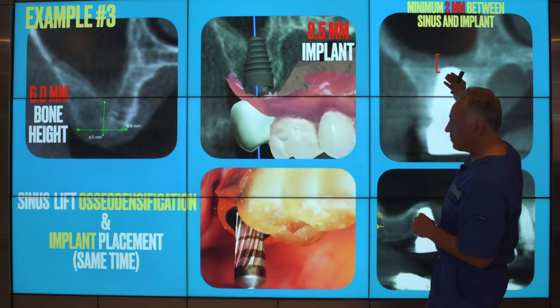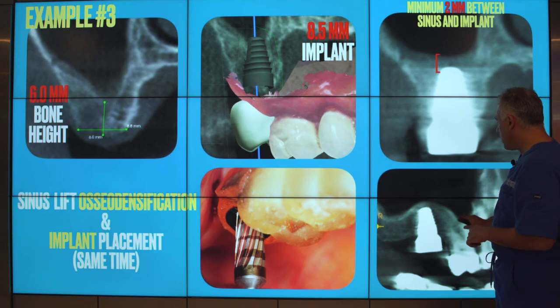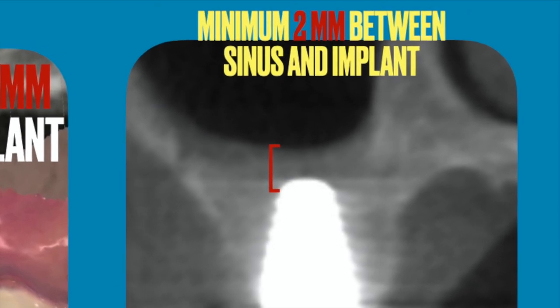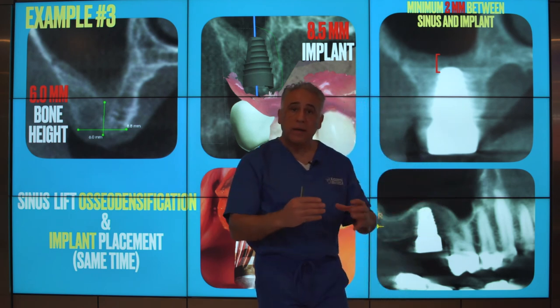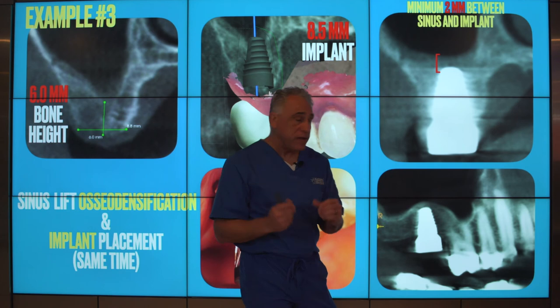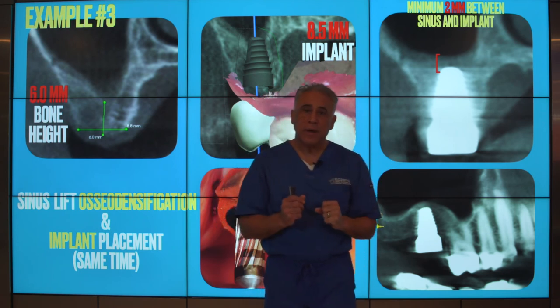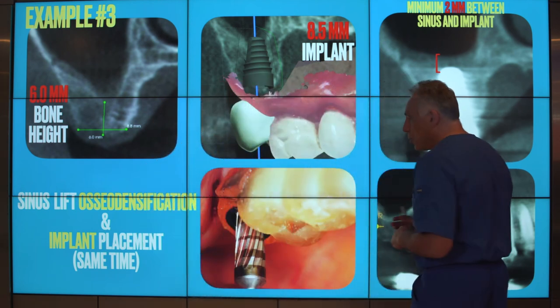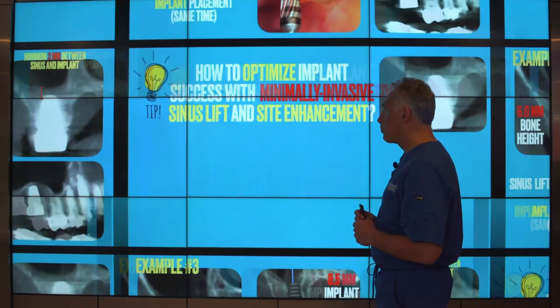So here we are again with a sinus lift using the osteodensification technique, implant placement at the same time, and 6 months later, we have adequate support for the implant, proper bone coverage separating the sinus from the implant tip. This implant has the proper diameter, the wide body with good height, which optimizes the bone to implant interface and contact. At the same time with the densification, we converted the bone to a more dense bone. So we really met the qualifications or the properties that we were looking for earlier. Better bone, more bone, and also better contact with the implant and better integration for long-term results.